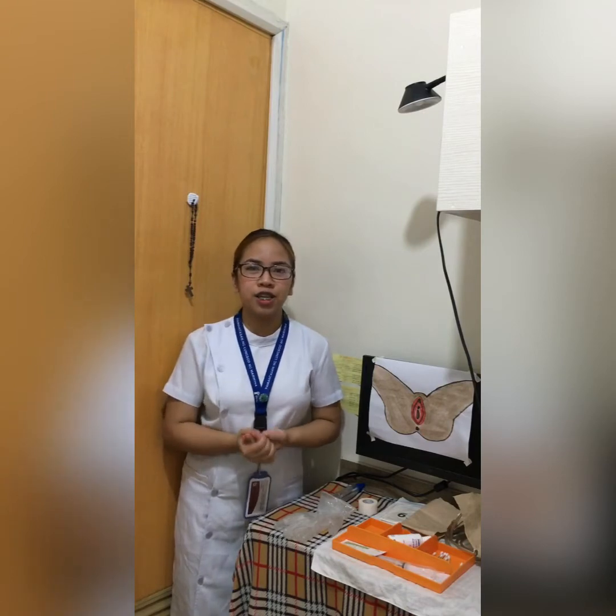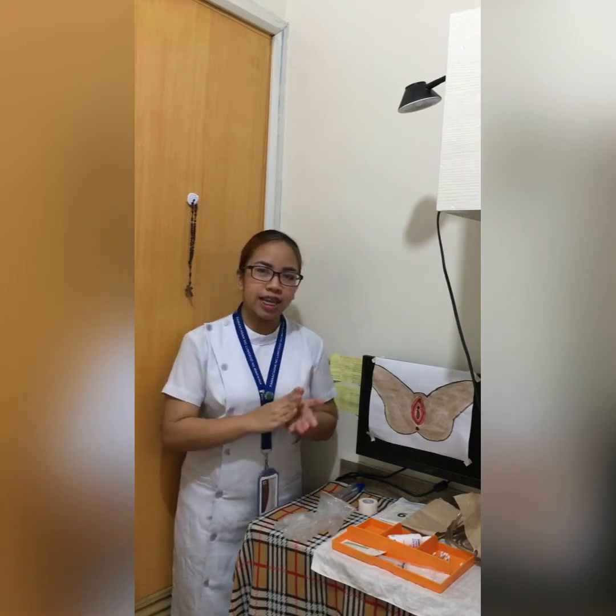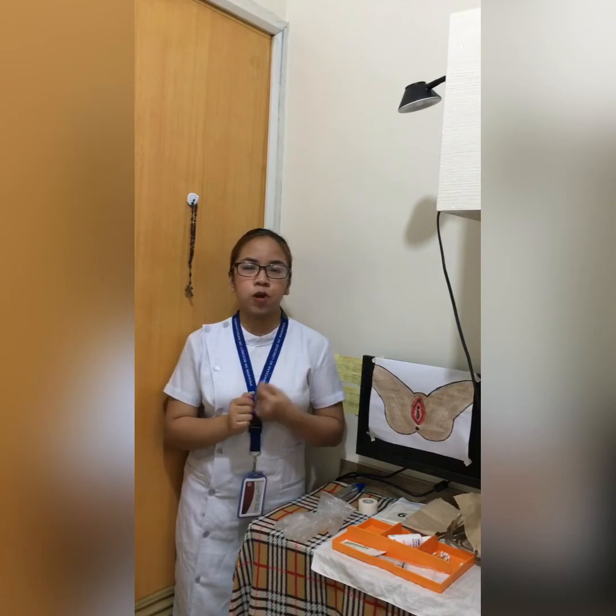This is usually performed only when absolutely necessary because danger exists in introducing microorganisms into the bladder. So those clients who have lowered immune resistance are at greatest risk of acquiring it.